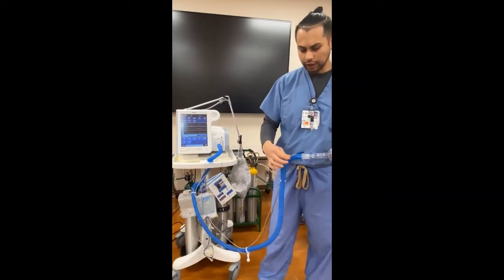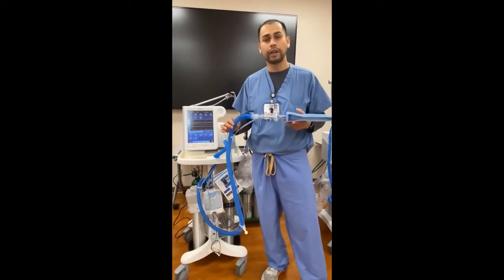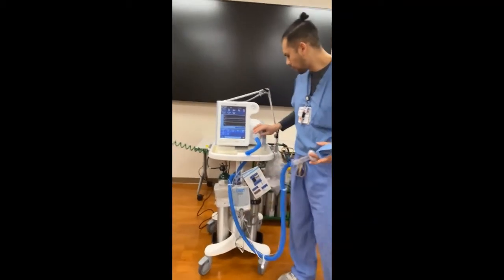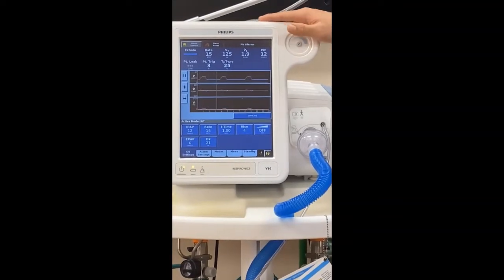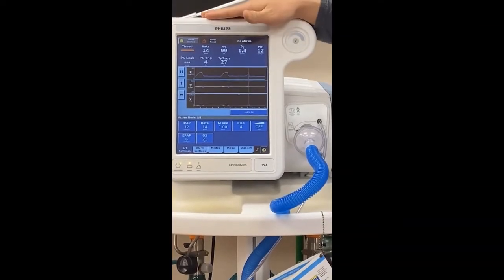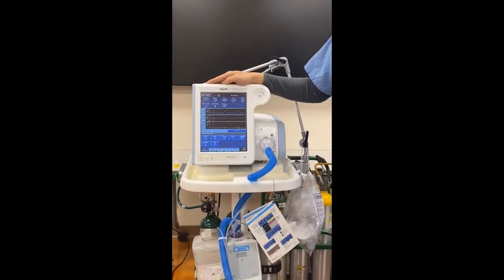We also have the heater attached to it, which gives humidification for the patient for comfort, for not delivering cold air and drying up the mucous membranes there in the airways. A couple of important things here is that if the patient is still tachypneic on the BiPAP and they're unable to get stable while getting ventilation help, chances are they may need a higher intervention like a ventilator.